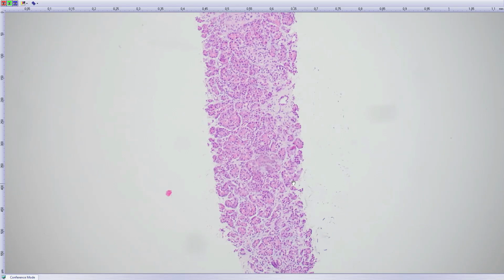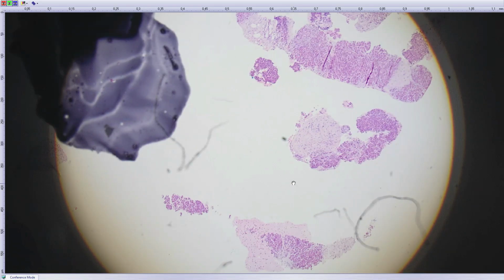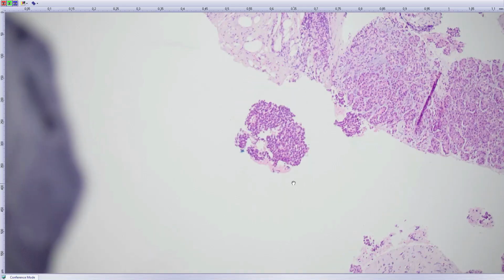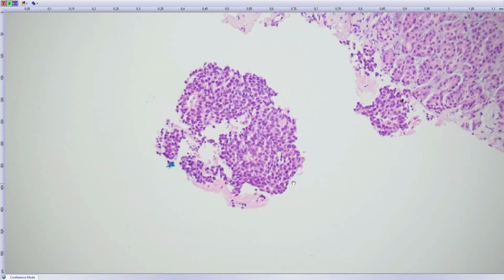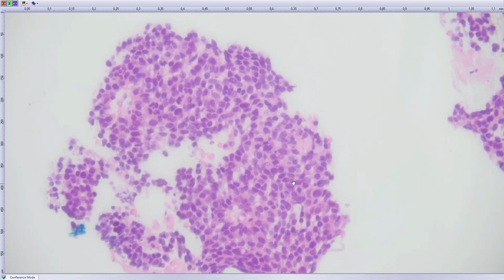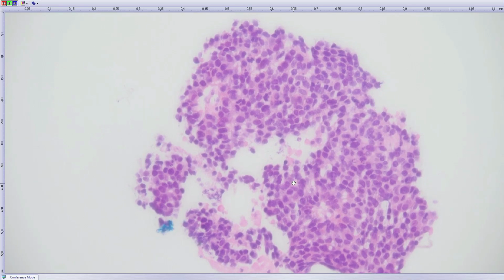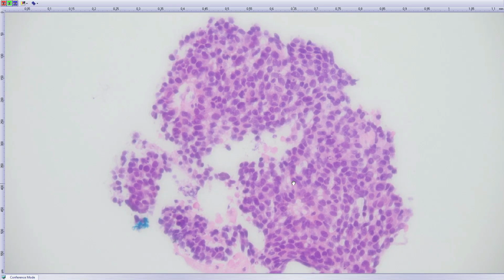Okay, my next case is another pancreatic biopsy. In this case it's, let's say, a younger adult patient. You can see still normal pancreas here, normal pancreas here, almost nothing. Okay, and then there are only these very, very small pieces of tissue showing something else. So clearly a high-grade malignant tumor composed of these very small cells with apoptotic bodies. There are some mitotic figures here.